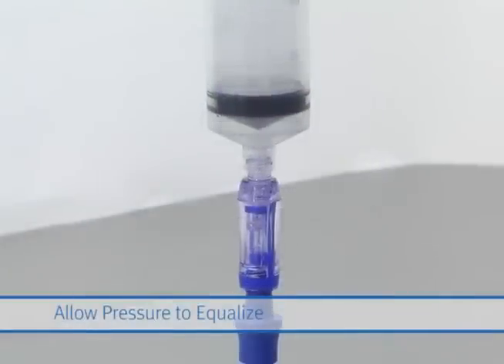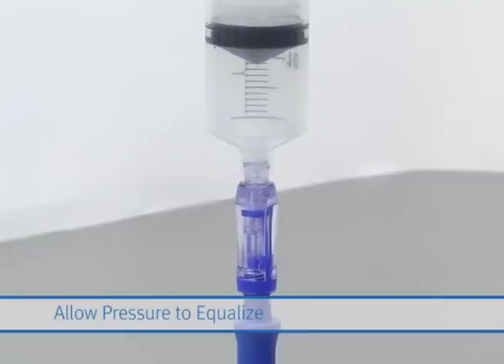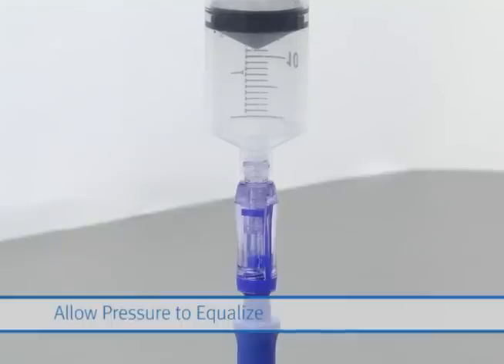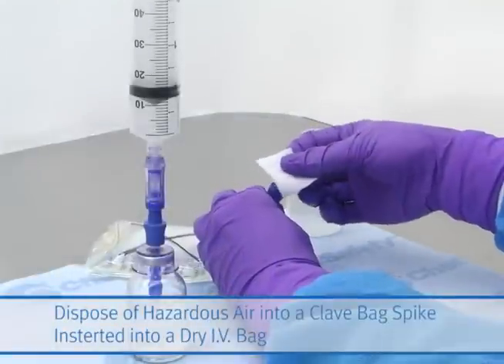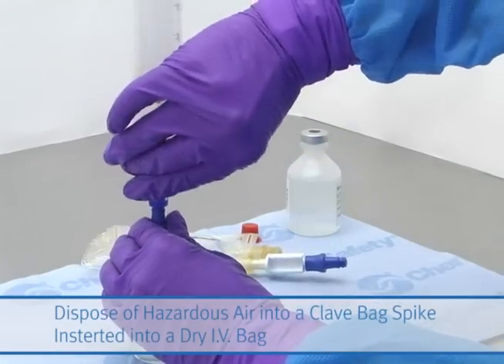Release the syringe plunger and allow it to back out of the syringe to equalize the pressure. The syringe may then be discarded, or you may dispose of the hazardous air into a clave bag spike inserted into a dry IV bag.